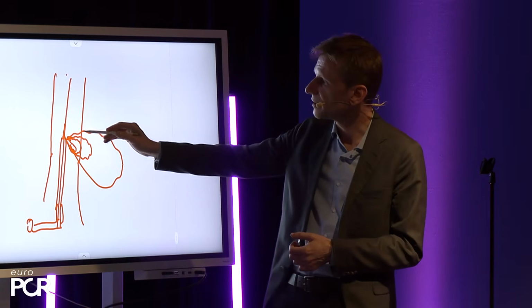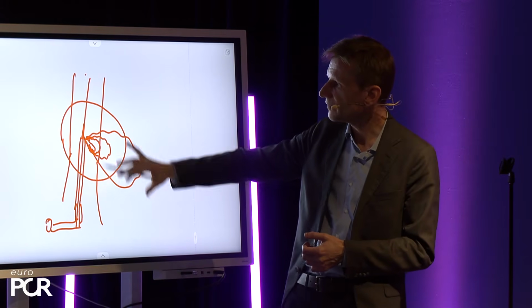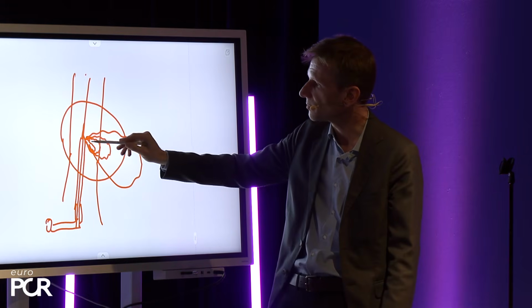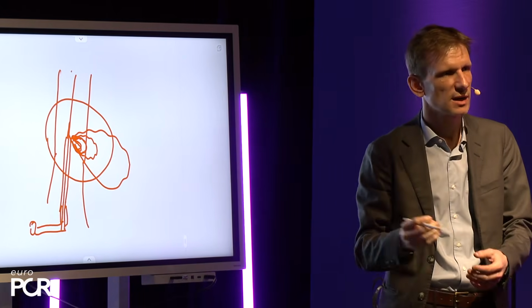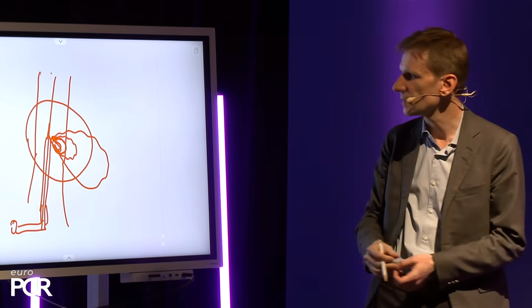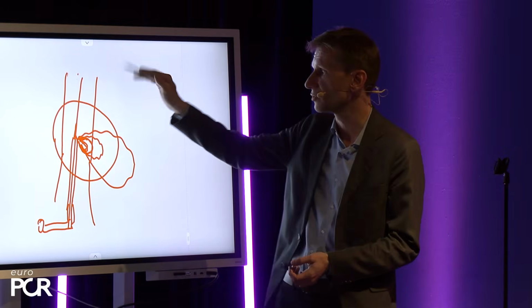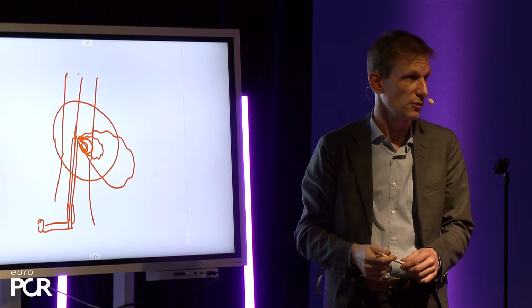But I think it gives a nice visual assessment of your closure. If you have a perfect closure, good, you're good to go and you can close completely. If you have some minor or moderate oozing, you can supplement with another mechanism like a plug-based device on top of your suture-based. And if you have a complete catastrophe, you can consider other tools, either cross over and go for your stenting, or, if you have a Manta, for example, go for a Manta bailout.